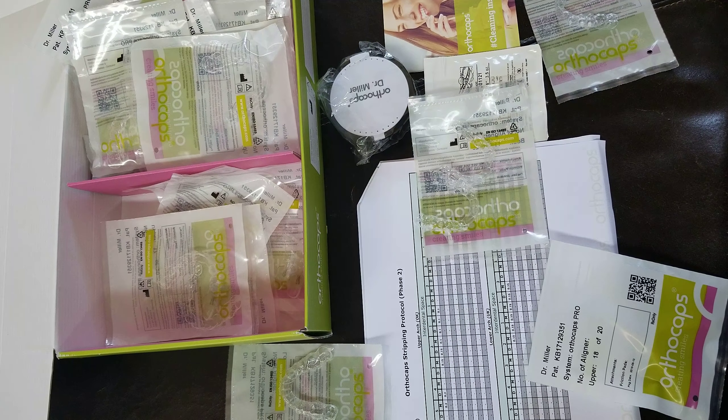This is the IPR chart — I like it because it's really easy to read. They also white label everything, so it'll have your doctor's name on it. It actually came with two cases — my daughter stole one of the cases. She threw her aligners in it, scratched out the name Miller, put her own name on it, and declared herself a doctor. It has a mirror, so she thought it was the most incredibly cool case ever — thumbs up from a nine-year-old. You also get a bag, instructions, and a basic treatment plan.